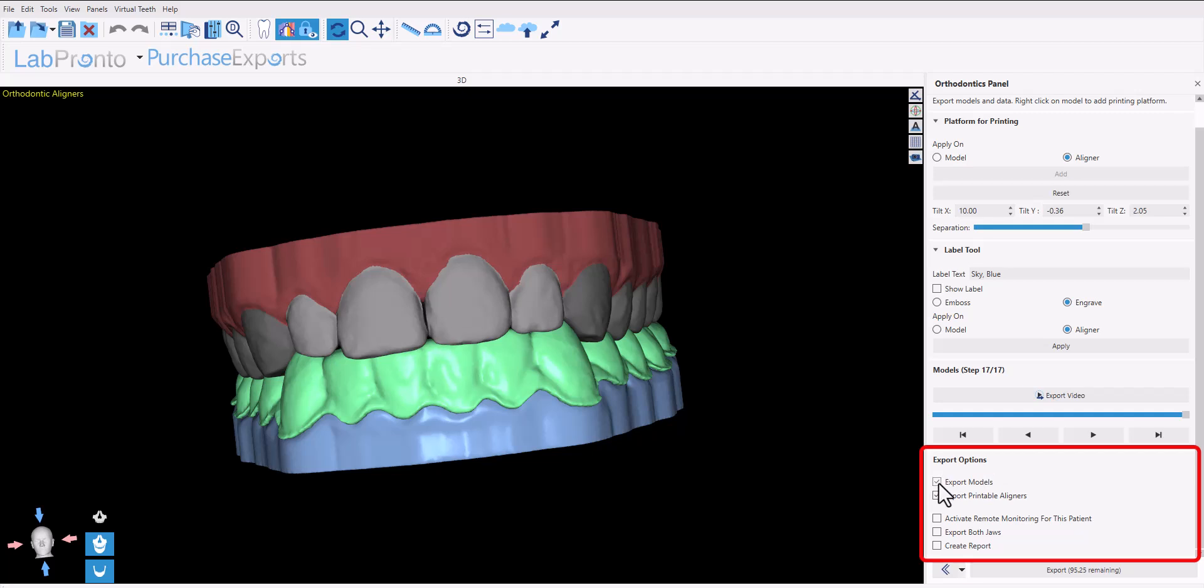Click 'export models' to export the models. Check the checkbox 'export printable aligners' to export the aligners as well. Export both jaws and create reports.